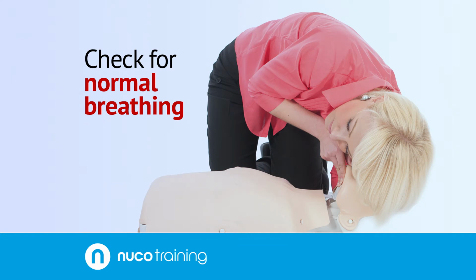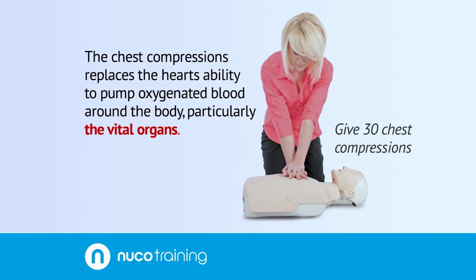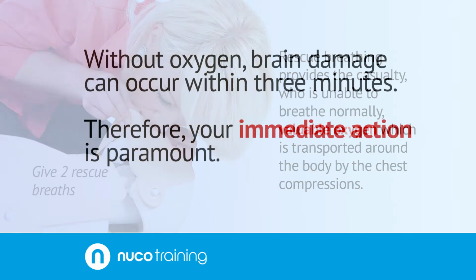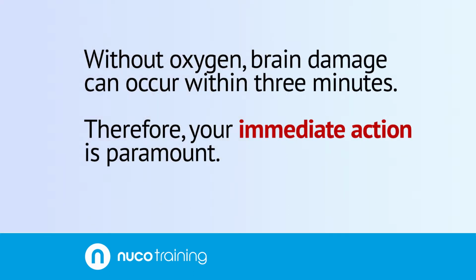Cardiopulmonary resuscitation, or CPR, is an emergency procedure that is attempted in an effort to return life to a person who is not breathing normally, as well as to keep the vital organs fed with oxygenated blood and in particular our brain. This procedure combines chest compressions with rescue breaths. The chest compressions replace the heart's ability to pump oxygenated blood around the body, particularly the vital organs. Rescue breathing provides the casualty, who is unable to breathe normally, valuable oxygen, which is transported around the body by the chest compressions. Without oxygen, brain damage can occur within 3 minutes, therefore your immediate action is paramount.